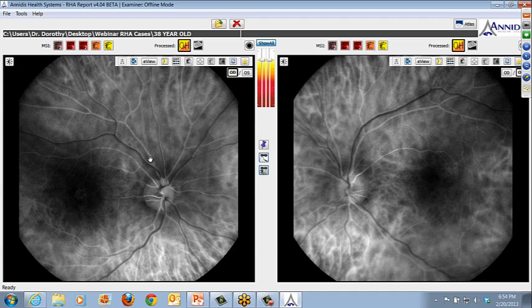I have actually seen some images where you can see the laminar flow, where there's return of oxygenated blood on the laminar side of the venules, for example. Sometimes your veins will look dark. Sometimes there's an area on the outer edge of the vein, and of course, that's oxygen return on the veins. Okay, so very much a difference here.